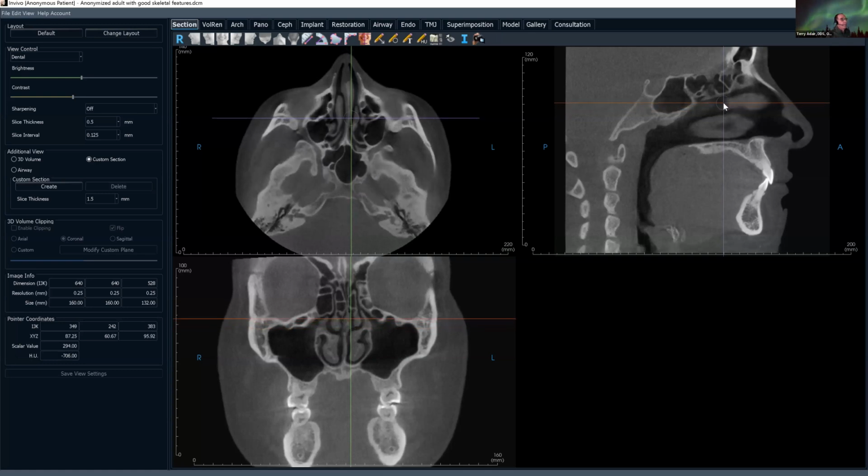At the same time, and I am going up and down a little bit just so I can, in detail, show you these structures that begin to show up. Right about the same time rotundum appears, you also see the carotid canals. The carotid does not come through foramen lacerum, as you may have been taught in dental anatomy in dental school, as I was. The foramen lacerum is an artifact of a dried skeleton or imaging.